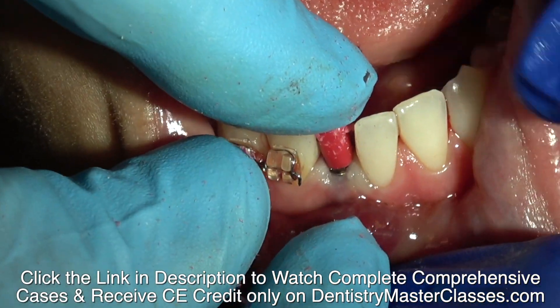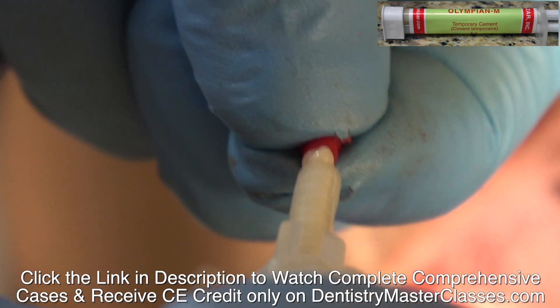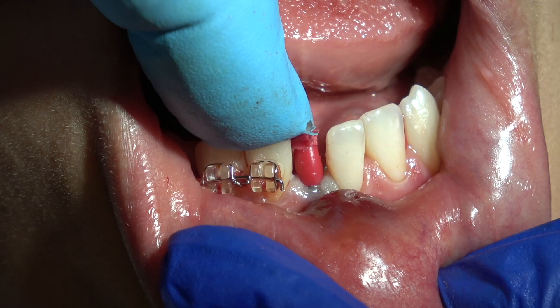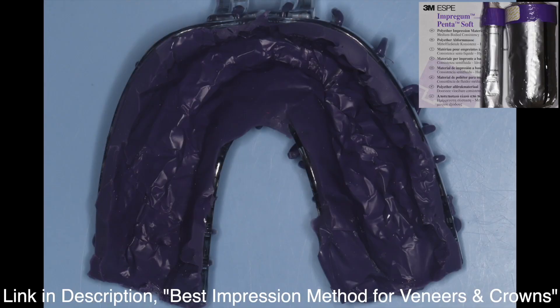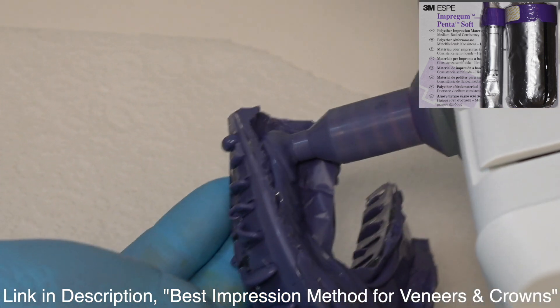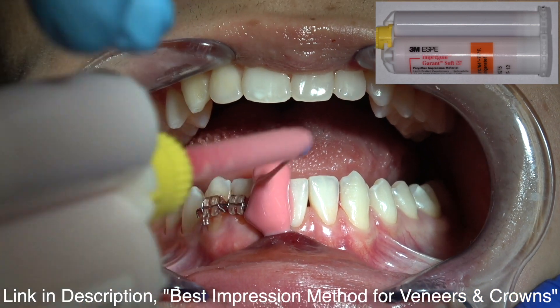I'm going to place provisional cement with Vaseline in the impression coping just so it sits tight on the implant. If I didn't use this, it would move around a little bit. I want to be sure that it's tight on the shoulder and not touching the adjacent teeth. Polyether with custom tray impression. These are really complicated cases because of all the points I made: thin ridge, adjacent teeth, the right angle of the implant going into the alveolar process — you don't want to touch the adjacent teeth. Very tricky.